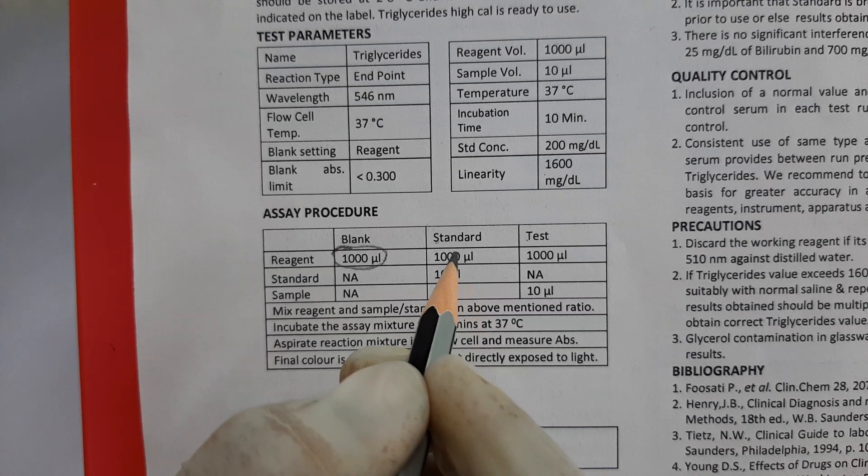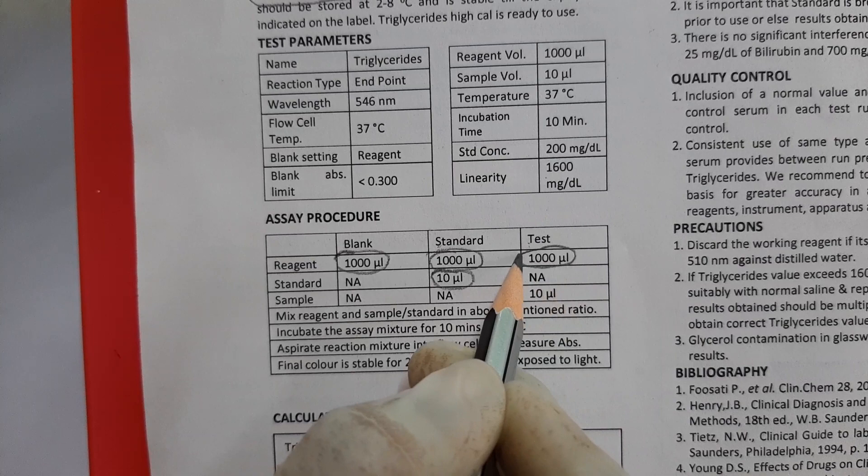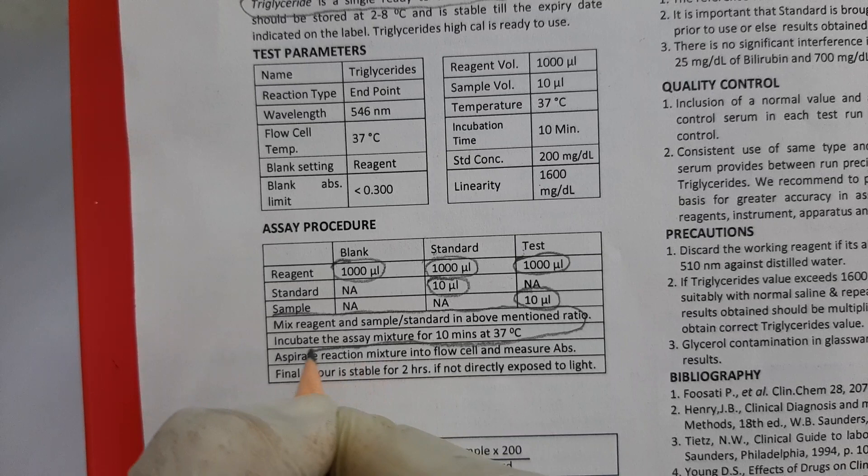In the second tube of standard, we will take 1000 µL of reagent and 10 µL of standard. In the third tube of test, we will take 1000 µL of reagent and 10 µL of patient sample.